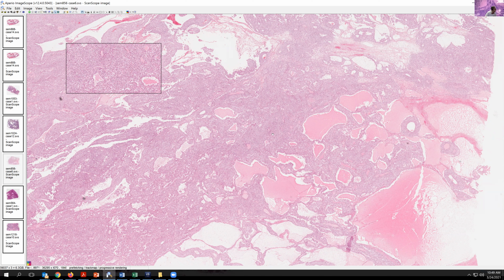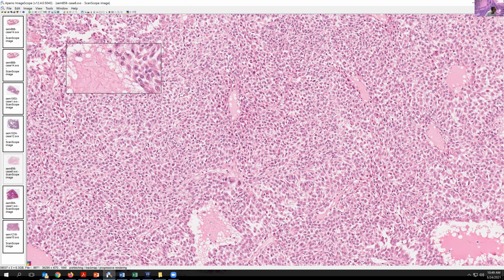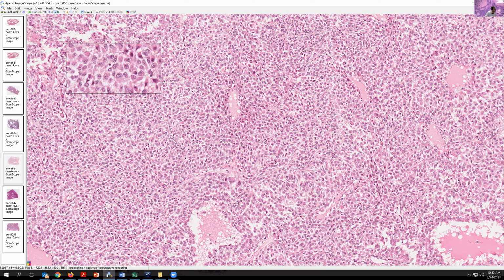Well, I'm getting the uncomfortable sense that this does not want to, there we go. Okay. So here we go. As we come into high magnification, we can see these sort of cystic spaces falling apart. We see a pretty good degree of nuclear atypia. So again, this sort of mimics the pattern of a juvenile granulosa cell tumor. And we would wonder about that possibility.